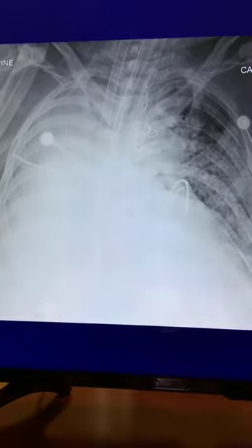All right, 3, 2, 1, I'm impatient. That is an ECMO catheter, E-C-M-O, ECMO. Intensivists love this, surgeons love this. Go look it up, it's a whole other discussion. We could talk about it at some point. But it's basically doing the blood circulation for the patient on their own. It's an ECMO catheter, all right? We'll talk about that at some point.